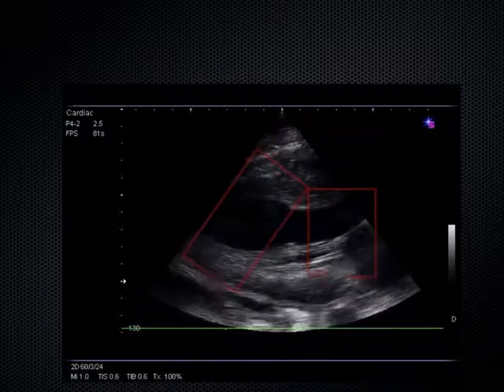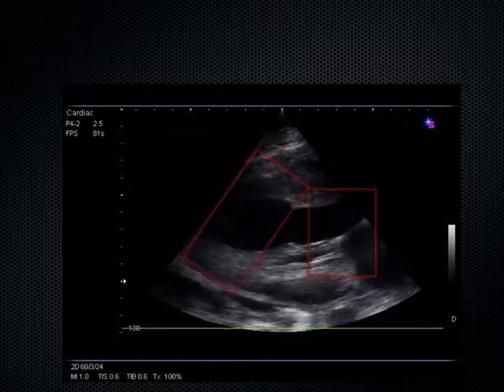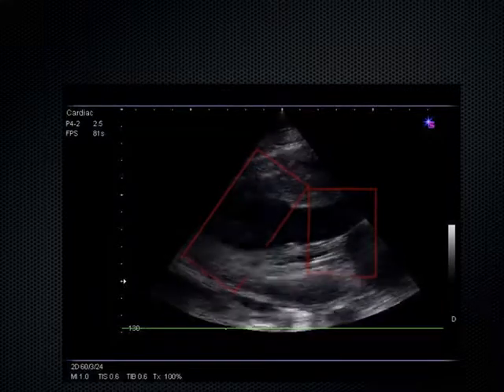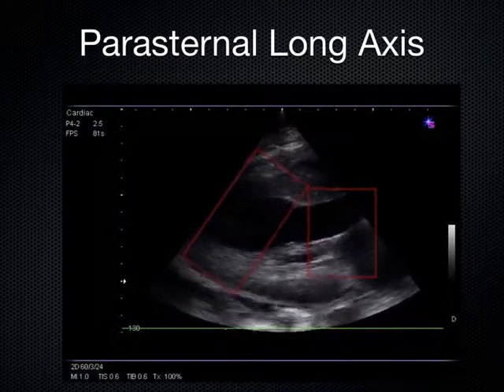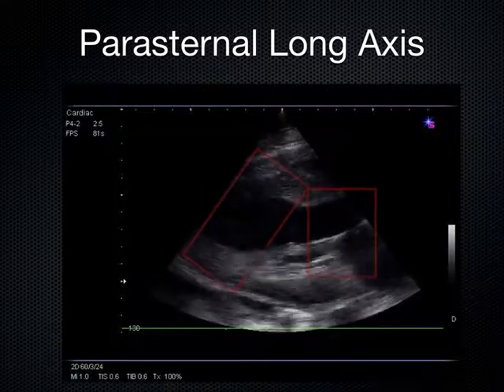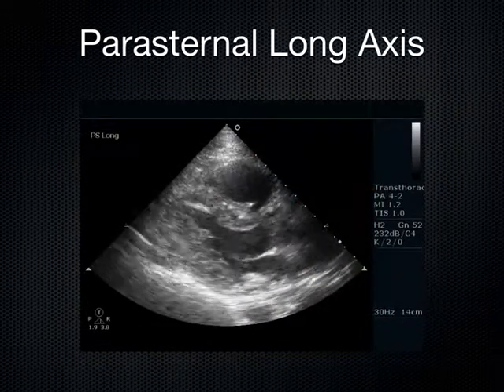So this person, if I gave them fluids, it could back up in their lungs, and I have to be very careful here. Because when the nurse comes to you and says, hey, this patient's hypotensive, we've got to resuscitate this guy, how much fluid should I give him? That's their first question to you. So you just have to be careful that you don't start dumping fluids into a heart that looks like this. That's why, with anybody who's hypotensive, I immediately go to the bedside and take a look at their heart, and then I make a decision about whether or not to give fluids.